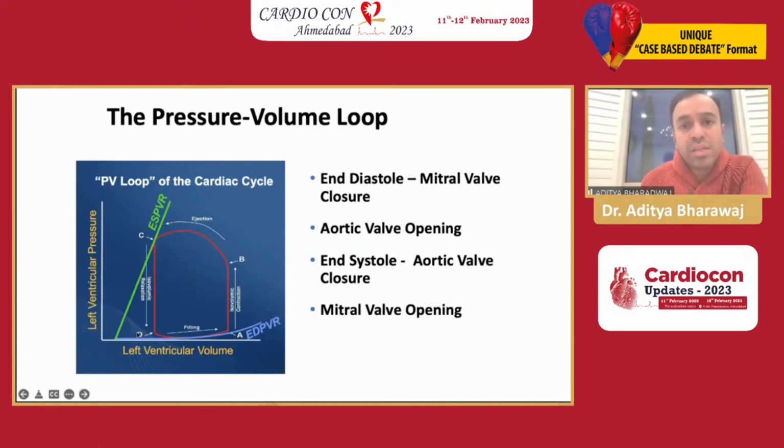So I think we're all quite familiar with the PV loop, where you have left ventricular volume on the x-axis and left ventricular pressure on the y-axis. And so this is the diastolic filling.